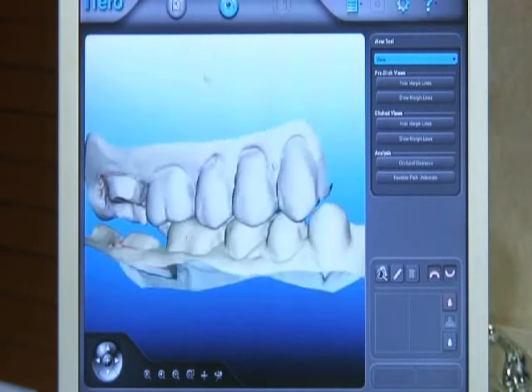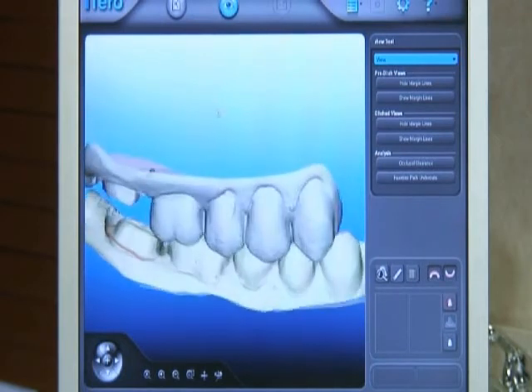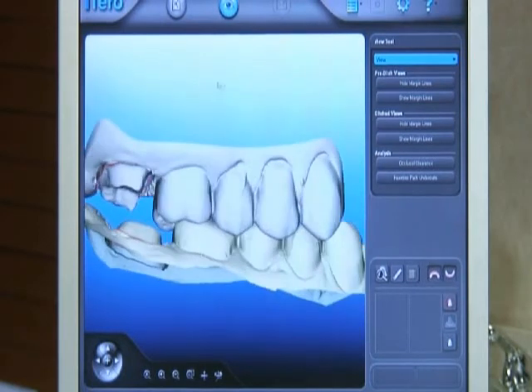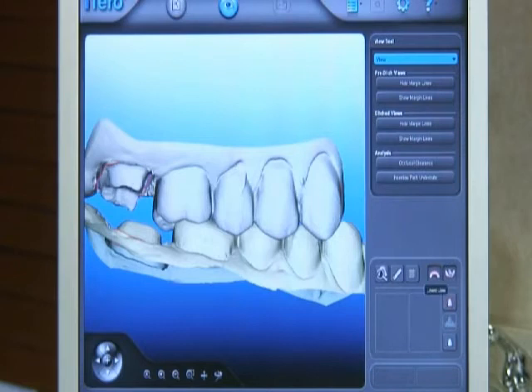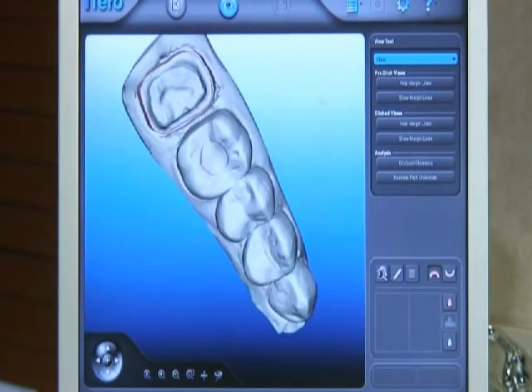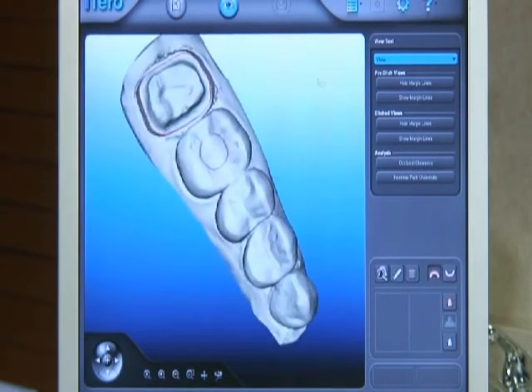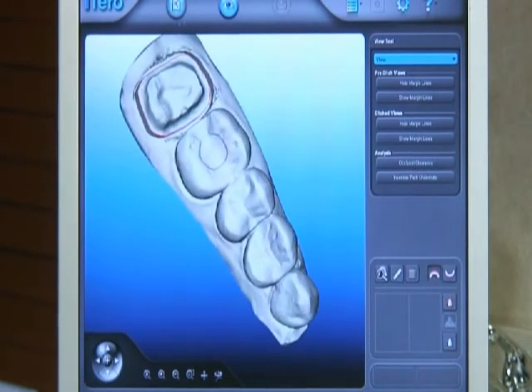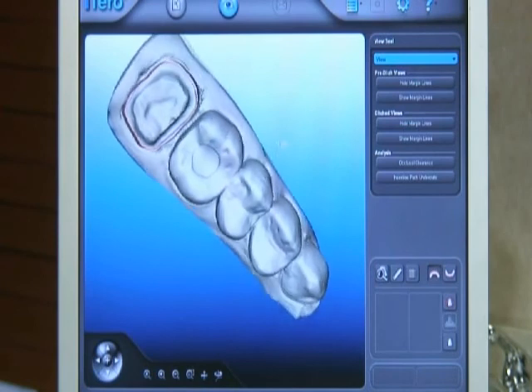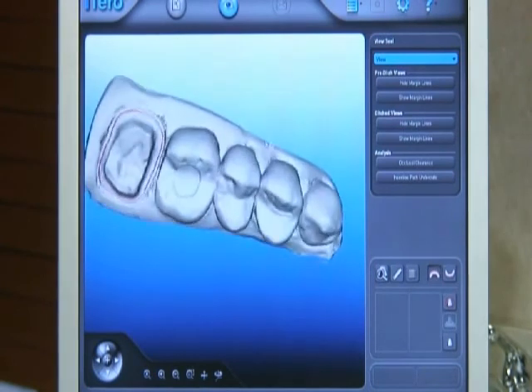Here's the teeth biting together. I can show them individually — there's the upper. See the margins? The border is marked in red, as you can see here. Let's move that around and get them both back together here.